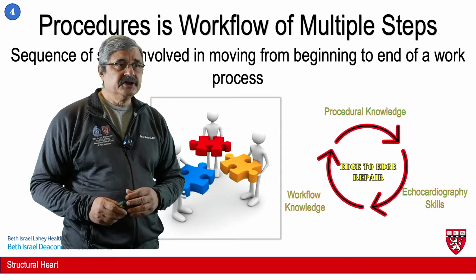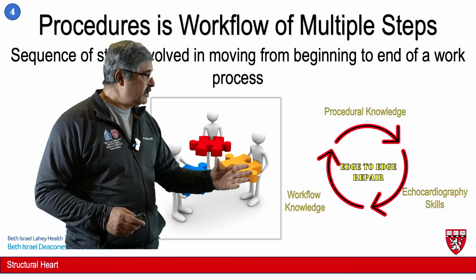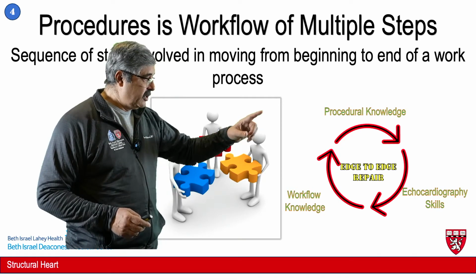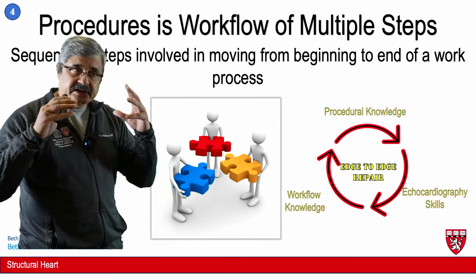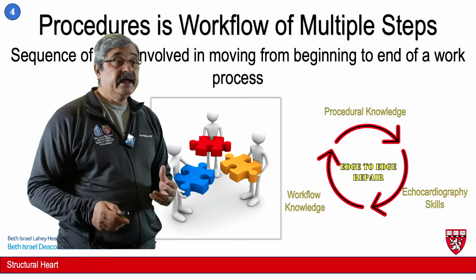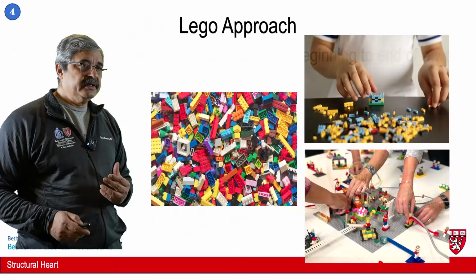We pay a lot of attention to developing proficiency rather than expertise, and we think that the proficiency of performing an edge-to-edge repair is based on 3 components: procedural knowledge, workflow knowledge, as well as echocardiography skills. And that's called the workflow. You have to know each and every step of the process before you go on and do it independently, and that is individually established through observer metrics when we have these fellows work with us in these rooms.